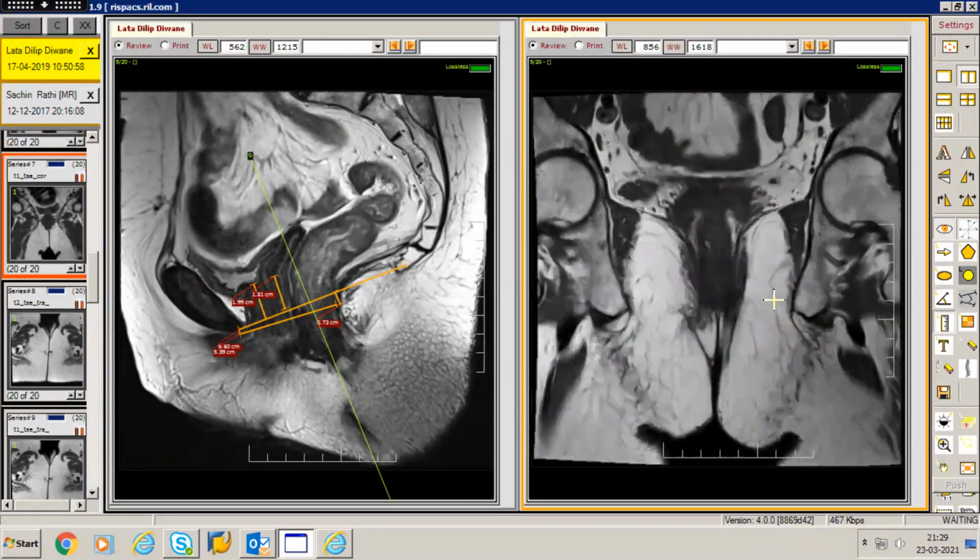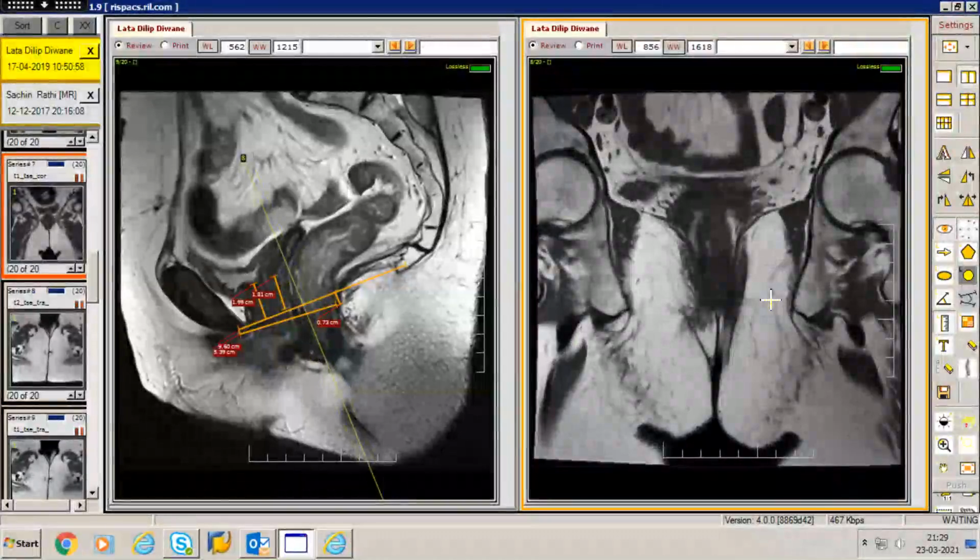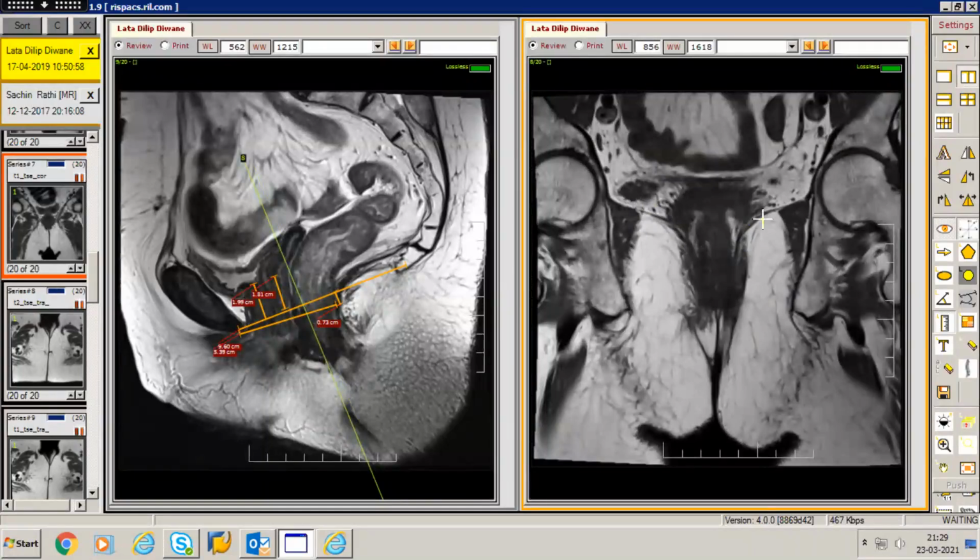So again, just to show you the levator ani muscles on the coronal plane, as we can identify here, the iliococcygeus, you can clearly see the superior convex margin. So what is typically described as an umbrella-like appearance. You'll be able to identify the iliococcygeus muscles very clearly here. At the same time, you will see the puborectalis over here and the sphincters much below that.